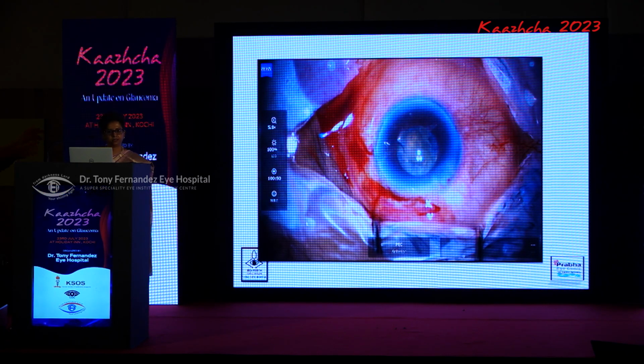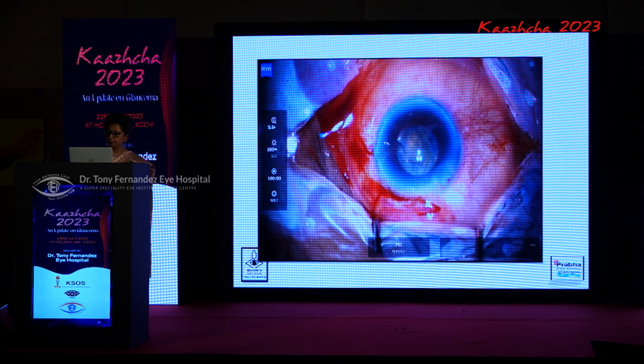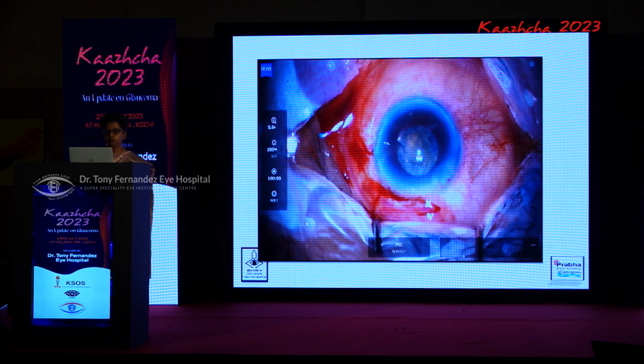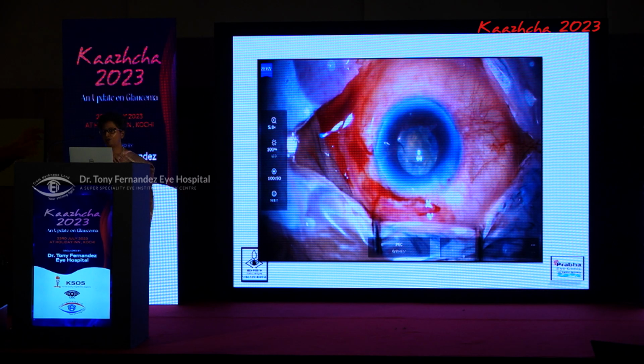We re-sterilize the sleeves. It is a reality. When you re-sterilize the sleeves, the sleeve loses its rigidity, and it can get compressed by the wound. Also, with this kind of active fluidics and Intrepid sleeve, Alcon recommends that your incision be 2.4 and not 2.2.